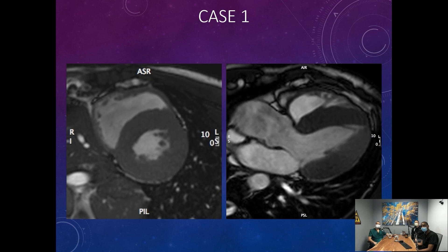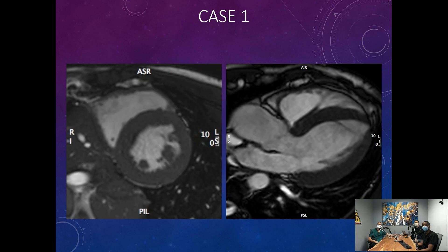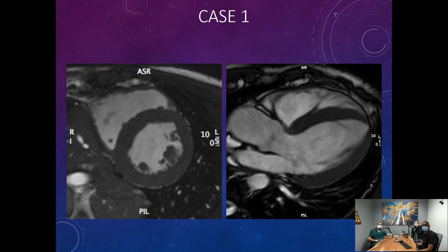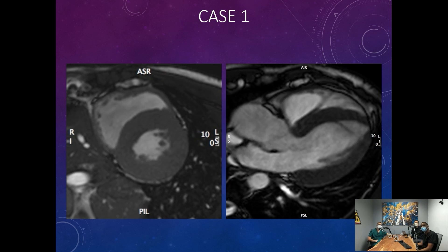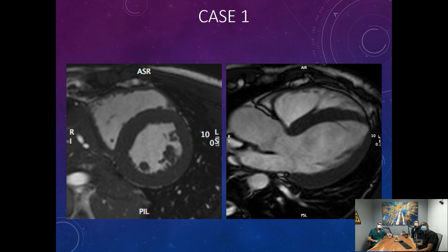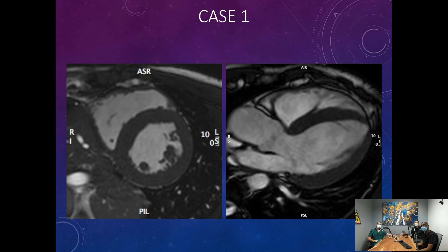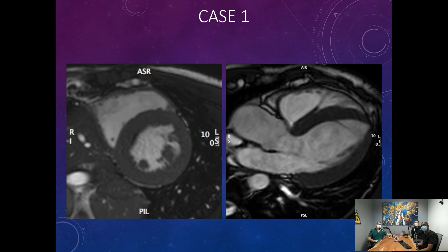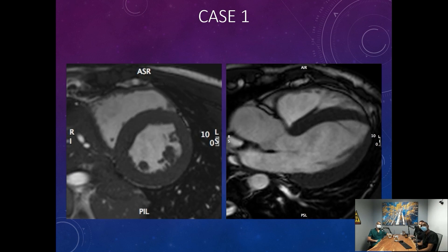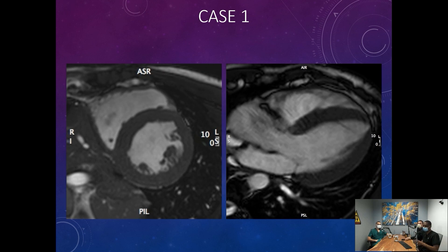These are cine images in steady-state free precession. On the left panel you have a short axis view at the papillary muscle level, showing both the left ventricle posteriorly and the right ventricle anteriorly. You can see that the function is actually very good, but the thickness of the muscle is quite increased on the left side.